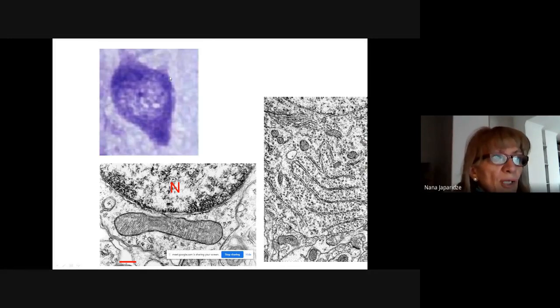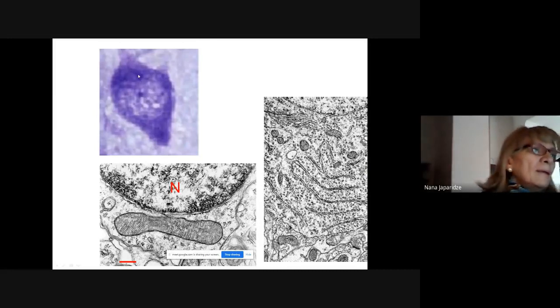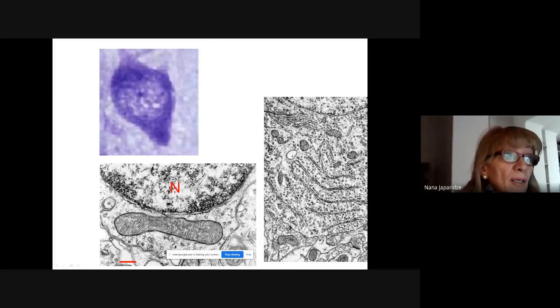And granulation, I mean, this is toluidine blue staining, that is, basophilic staining. It means everything that is stained here well contains nucleic acids and sulfate groups. So the small part of the nucleus is represented here.